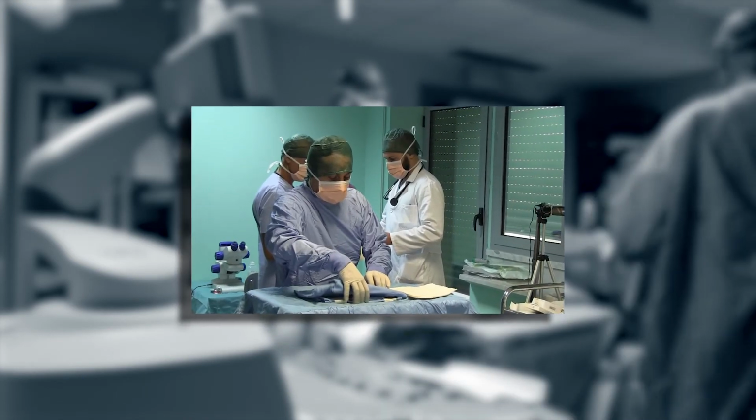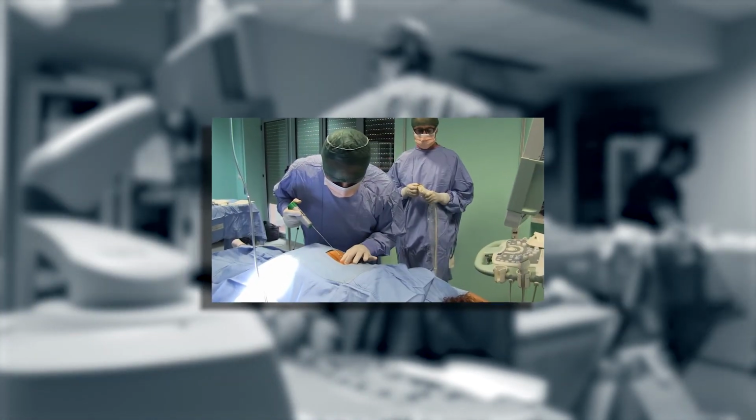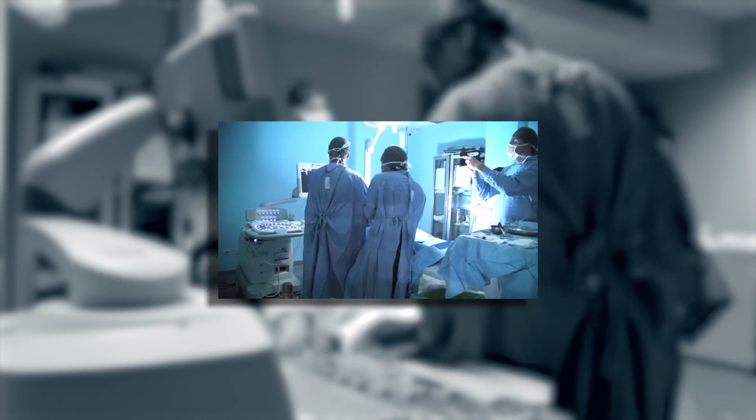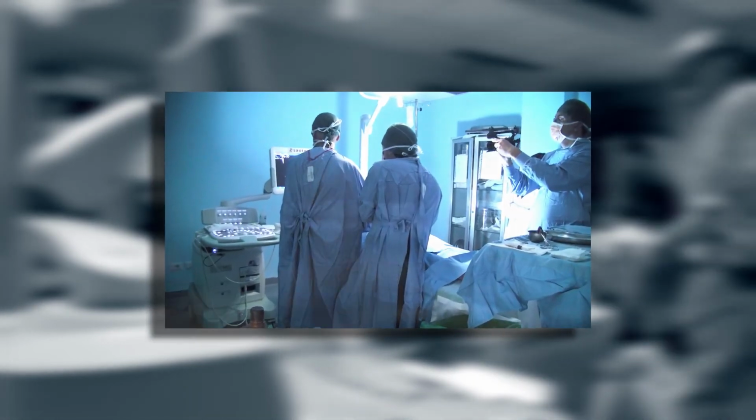Once renal biopsy has been obtained, the skin incision is compressively dressed and the patient is rolled into bed in a supine position for about 24-hour observation. Adequate post-biopsy monitoring includes checking the blood count 3 hours after performing the kidney biopsy, frequent blood pressure checks, especially in the early post-biopsy hours, and an ultrasound that can be carried out the following morning.